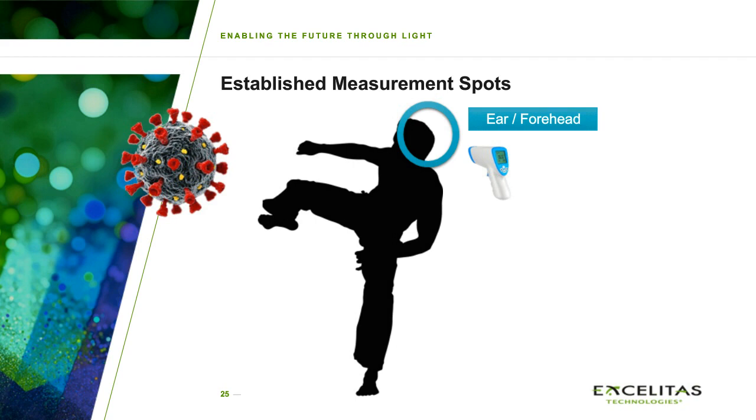So there is, from the application side, from the skin, an error which can be very tremendous when you have strong differences in ambient temperatures, and also, as I said, when you have very cold surroundings and you have a strong heat source, be it a microcontroller, a display, or whatsoever, which is heating the sensor from one side. Then you get a temperature gradient inside the sensor, and this is also affecting the sensor. So cold temperatures are generally the difficult condition for an accurate measurement, not the warm conditions.